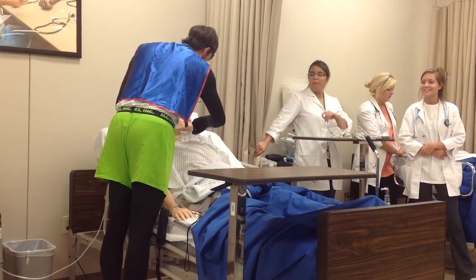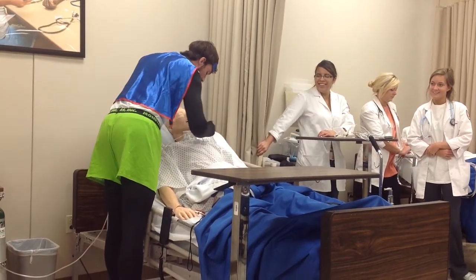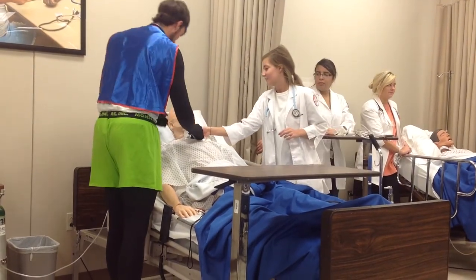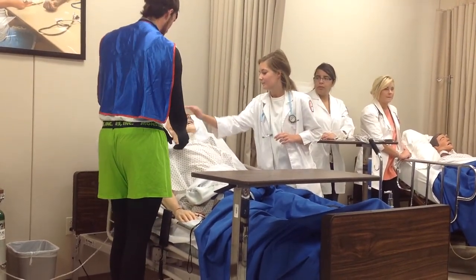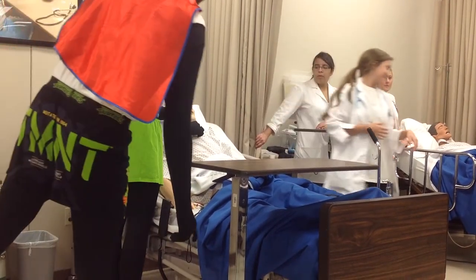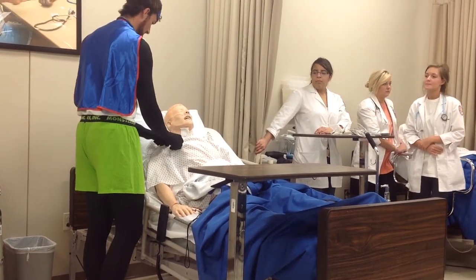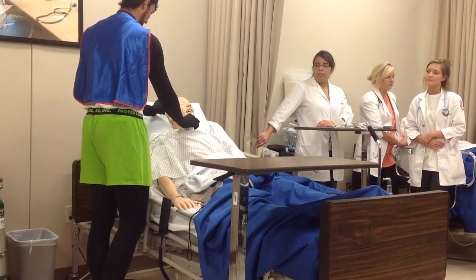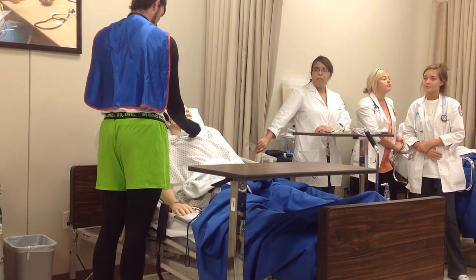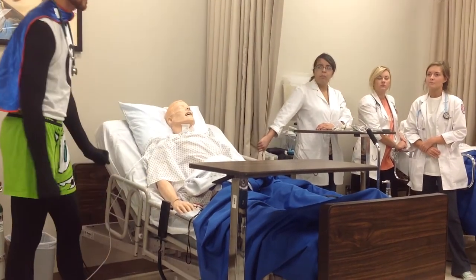If he has ears, it doesn't really stay very well because they don't really have... Get him on, Mike. Okay, once you get it on, it has a little fastener down at the bottom. You want to pull it up, but not too tight, just at a comfortable spot. And then hopefully you have a safety pin or something, because you want to attach that to their gown in case they're rolling over. They're not going to pull it out or roll on top of it, stuff like that.